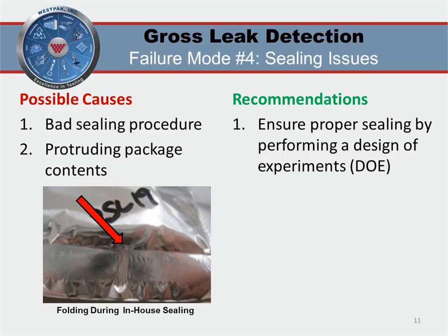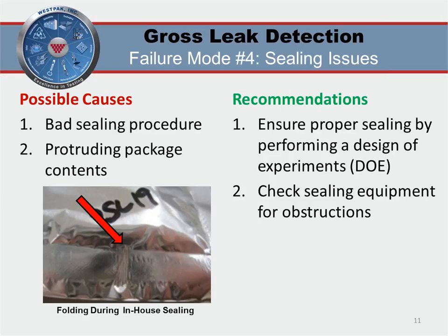So just make sure that you always perform a design of experiments on your sealing parameters and processes. Check your sealing equipment to make sure that there is nothing blocking it from making a proper seal, and make sure to perform a quick visual inspection if possible. This concludes bubble testing.